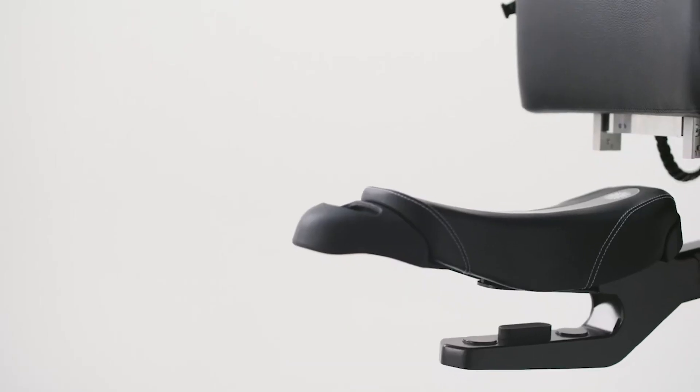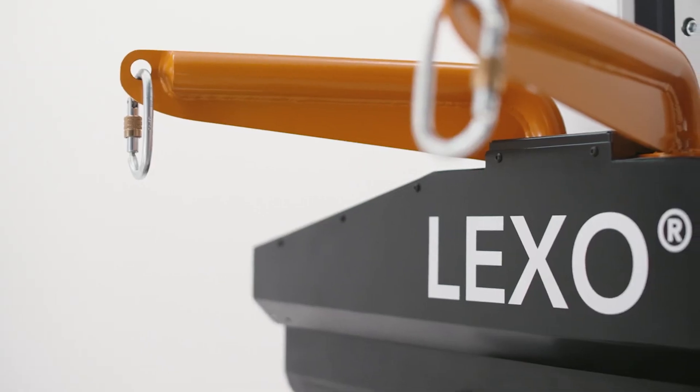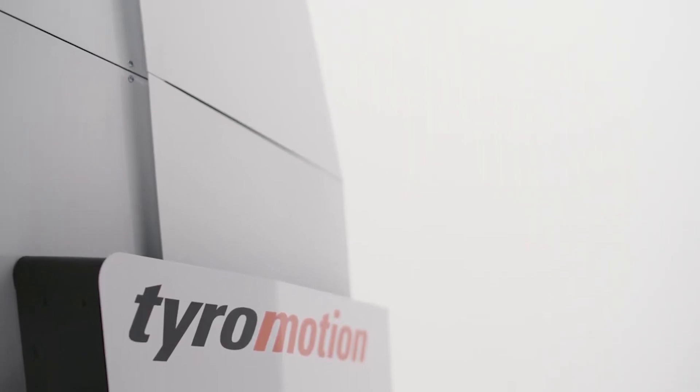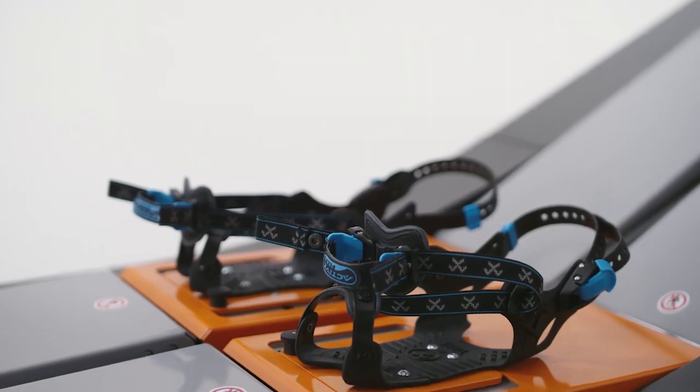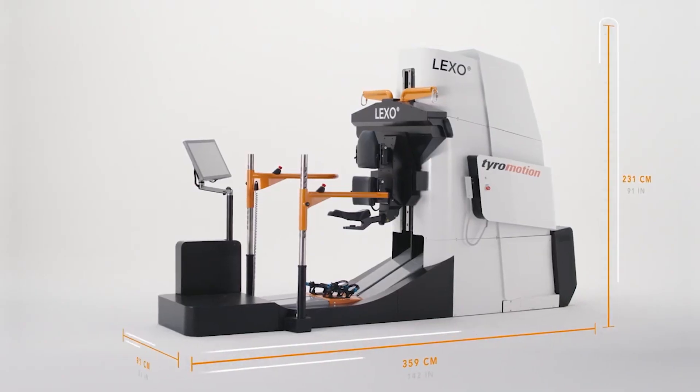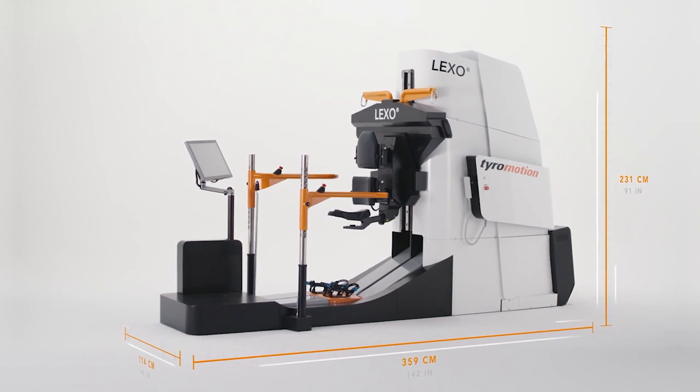The active training mode facilitates specific gait element training such as weight shifting and load-bearing. The integrated pelvis plus system emphasizes Lexo's high adaptability to the patient's needs. Another standout feature is its low overall height, making integration in existing and new facilities easy.